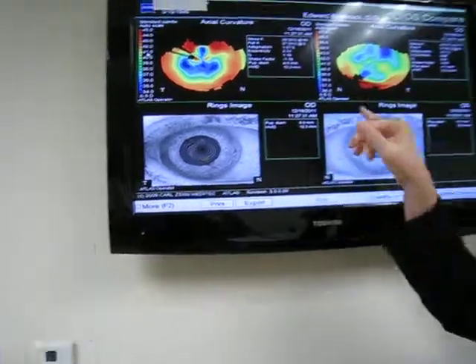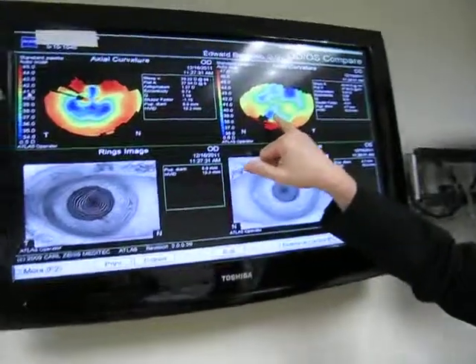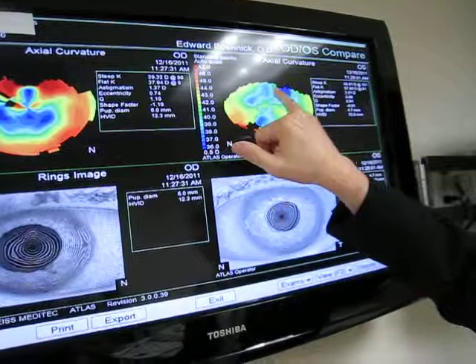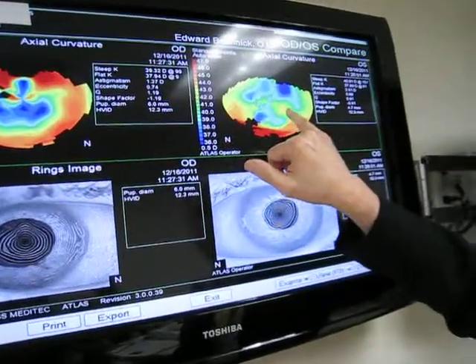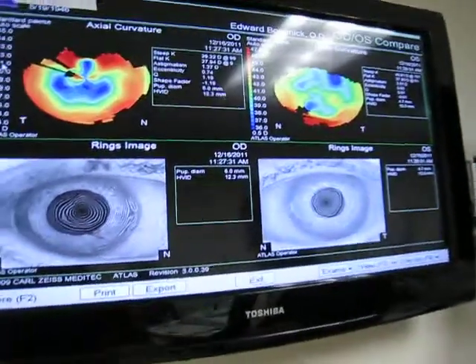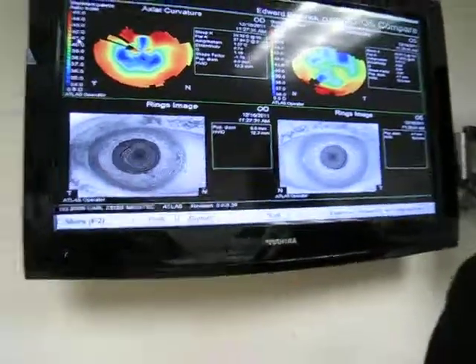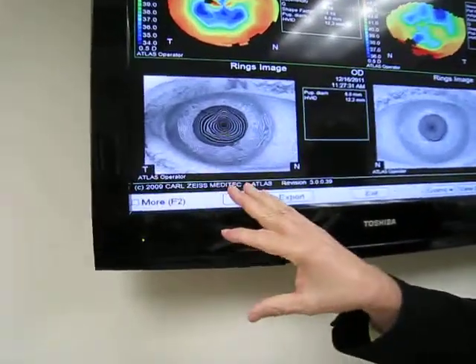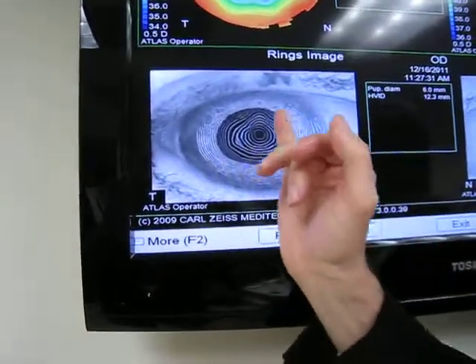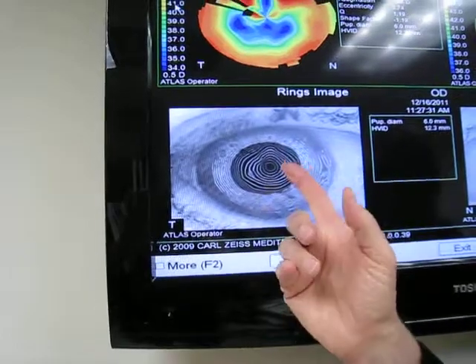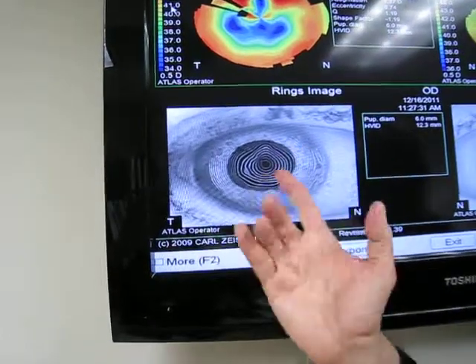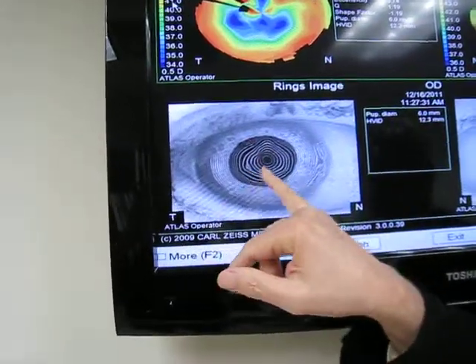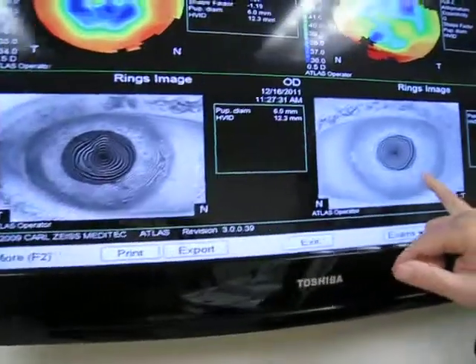The same thing over here — you have a smattering of blue areas, depressed areas, and elevated areas right next to each other in very close proximity. In addition, when the topography is done, you're looking at rings that should be perfectly round, reflecting off the cornea back into the computer. You can see how these rings are distorted — this is the right ring and you can see the left ring.